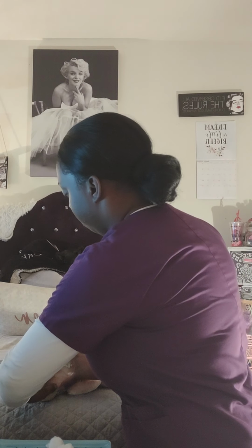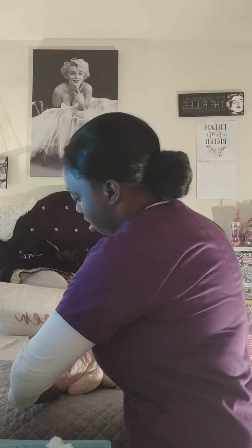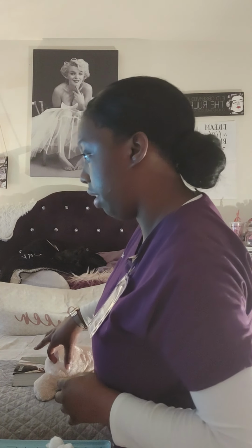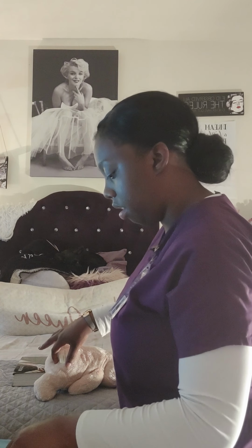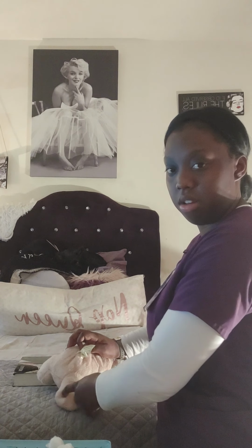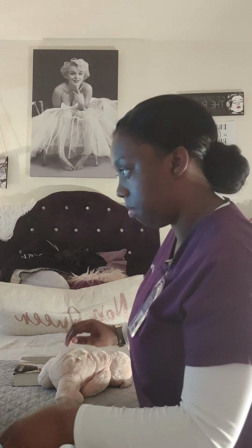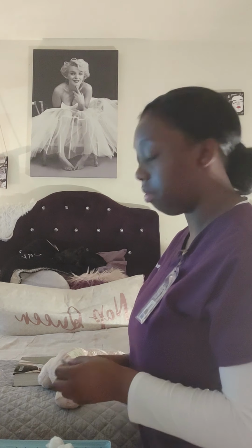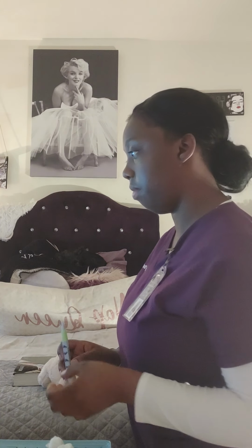I'm going to give this medication about right here in this V area. I know it's kind of hard to see, but I'm going to give it about right there. Cleanse the site, going inwards to outwards, allowing the skin to dry, uncapping the needle.